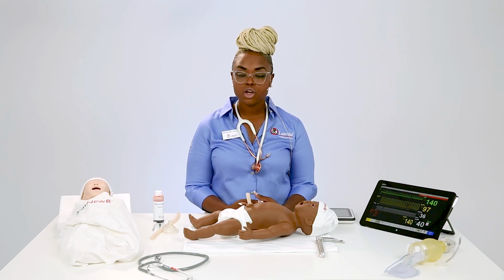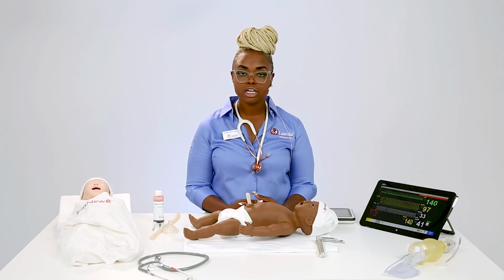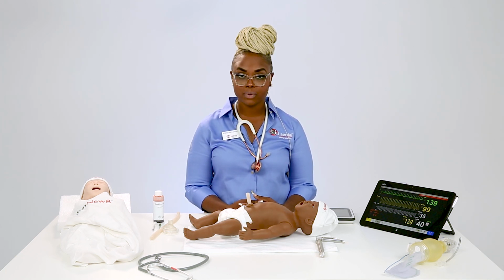Once that is done, you would then take your USB to micro USB and connect your Simpad to your computer to upload those raw files. With the Simpad, those files do have to be raw, and then you're able to play those sounds within your software. Great, thanks, Rotera. Next question is, does SimNewB seize?